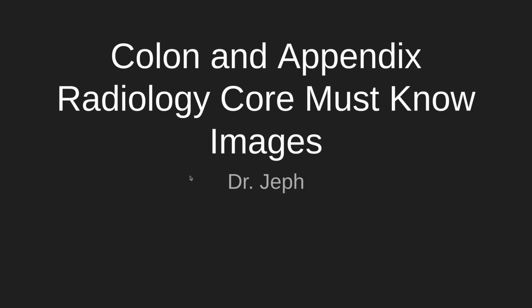Today, we'll delve into the fascinating world of abdominal radiology, specifically focusing on the large bowel. Our goal is to unravel the mysteries behind various must-know radiology findings and discuss their clinical significance. So, let's get started.